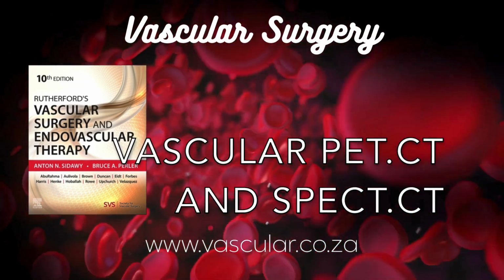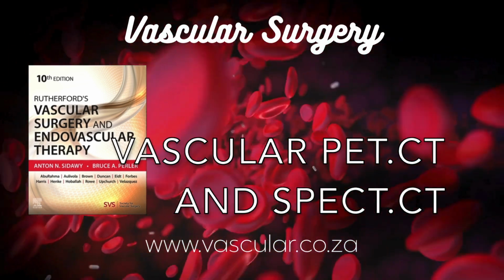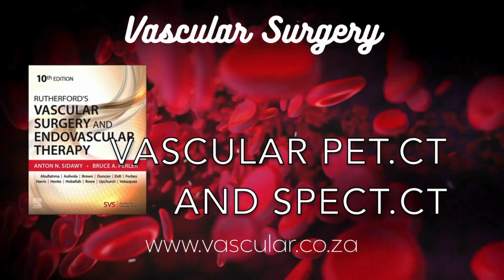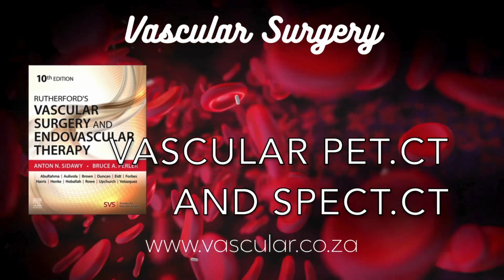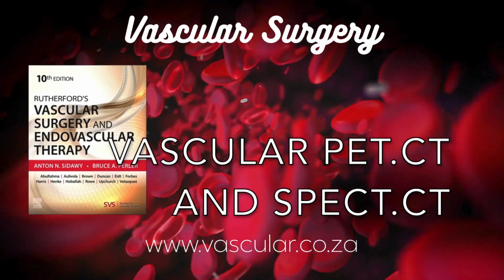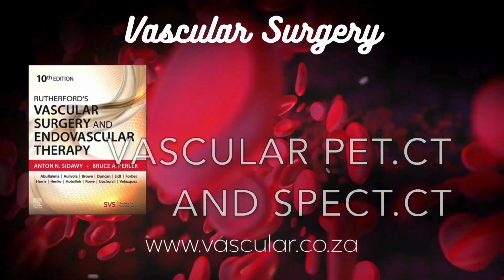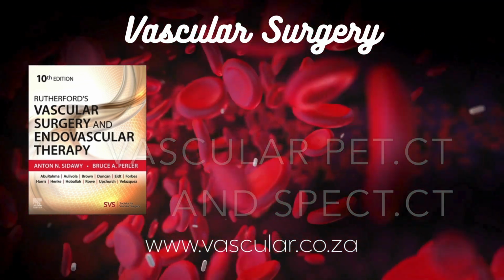Okay, FDG for inflammation and high metabolism. What else is common? Another important one, especially gaining traction in vascular imaging, is 18F sodium fluoride. Sodium fluoride, like in toothpaste. Sort of, the same fluoride ion, yes, but with radioactive 18F attached. Its main established use is actually bone scanning. Because fluoride ions get incorporated very readily into the mineral matrix of bone, especially where active bone formation or turnover is happening. It gets taken up quickly by bone and clears rapidly from the blood, giving really nice bone images. Okay, but how does that help with blood vessels?